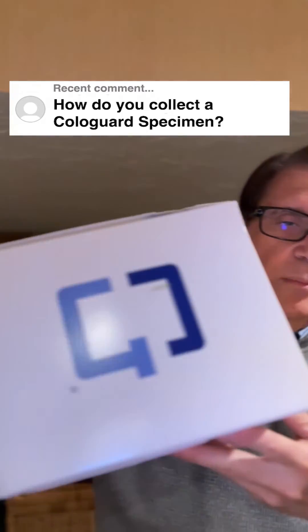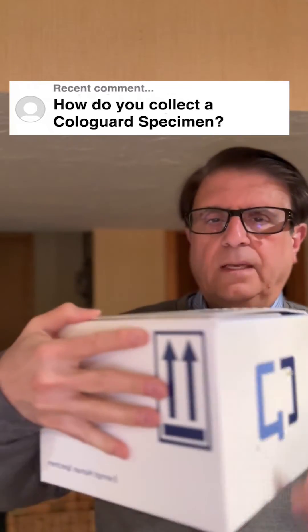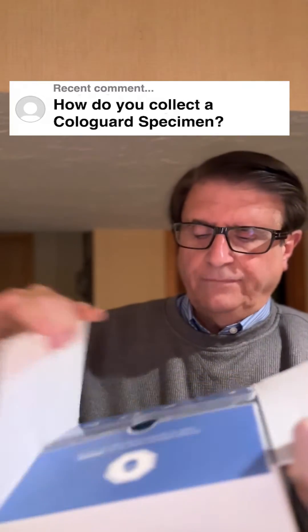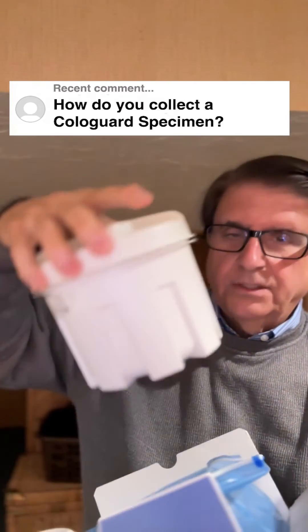Well, when your doctor orders a Cologuard test, they mail you this giant box — it comes to your house. And in the box, I've taken some of the packaging out. You'll get this container.